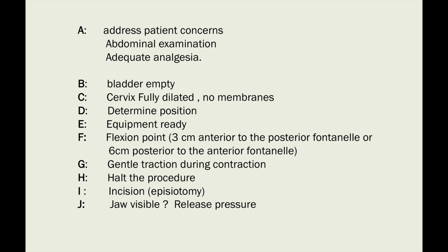And we need also to examine the patient abdominally, okay, to see how the head is engaged. So we have to be sure that less than 1/5 of the head is palpable per abdomen, otherwise we can't apply the Kiwi vacuum delivery. Okay?